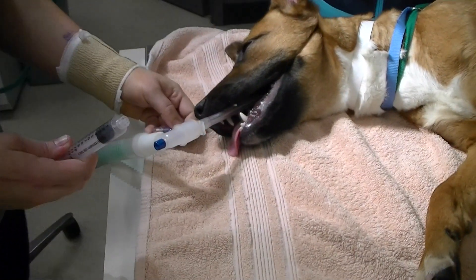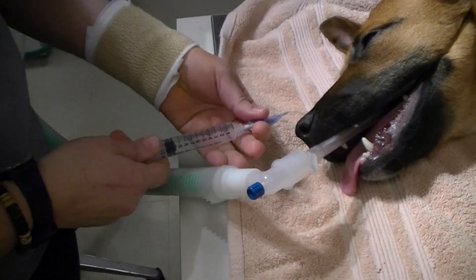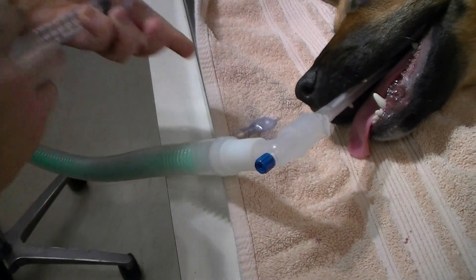I'm going to inflate the cuff — no more than 10 milliliters. I'm looking for negative pressure, and I'm getting it popping back at me right there, so that's what I want. I'll leave it there.